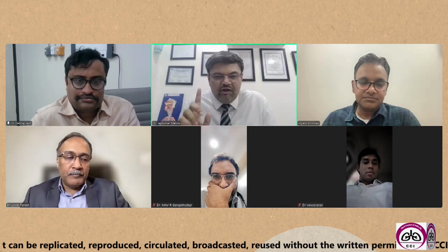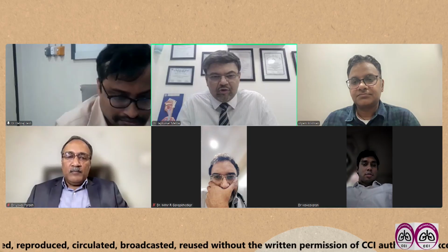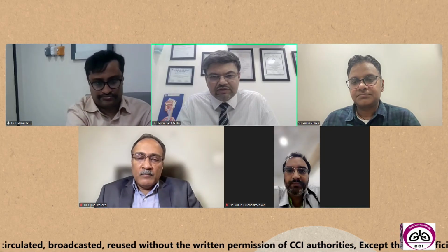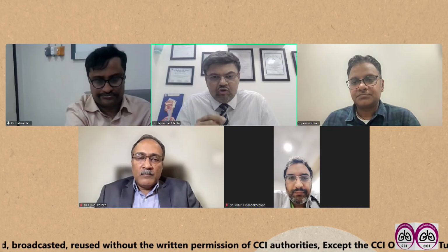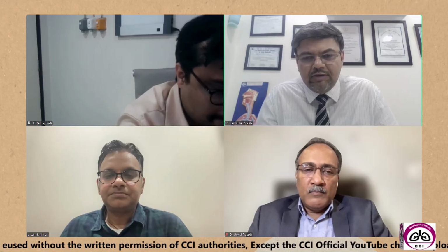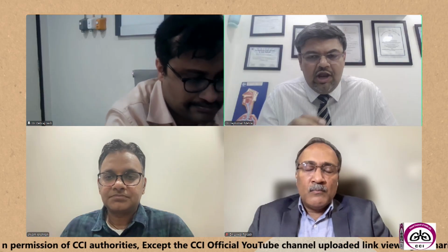Sir, I would like to add one more important aspect of the EBUS procedure, which we have made a protocol at our center. Pre and post EBUS, we always use a white light bronchoscope. Because we use Olympus, as we all know, the optics of the EBUS scope are not that great compared to a video bronchoscope. Endoscopic vision is not that great in the EBUS scope. So first we do a check scopy. It hardly takes around 2 minutes.